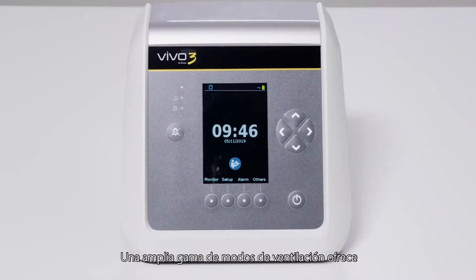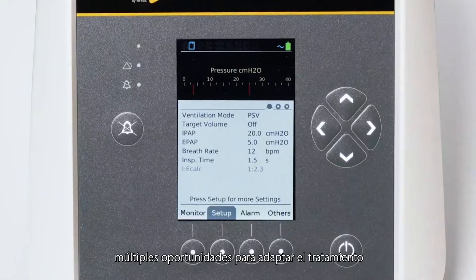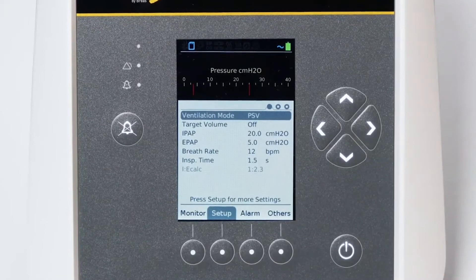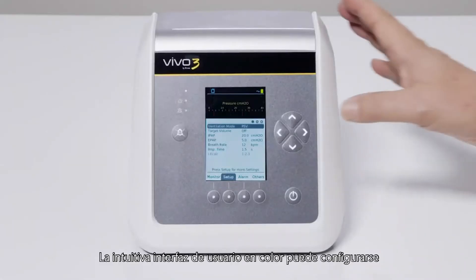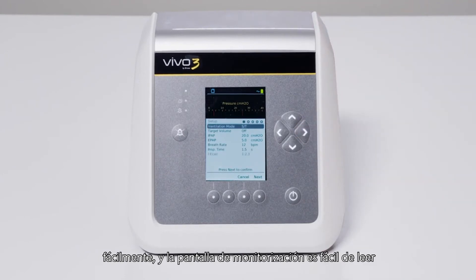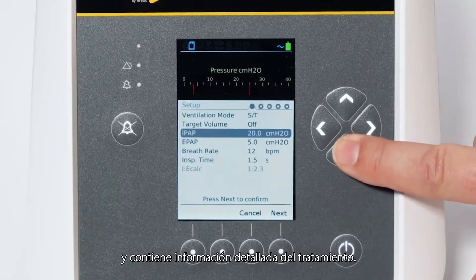A wide range of ventilation modes offers ample opportunity to adapt the treatment to the individual need of your patient. The intuitive color user interface enables uncomplicated setup, while the easy-to-read monitoring screen contains comprehensive therapy information.